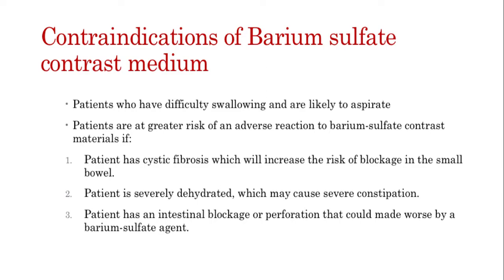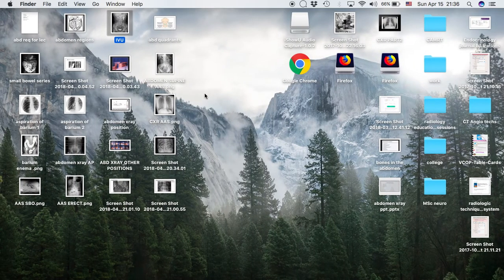So contraindications, this is a very important slide because barium sulfate introduction to the body can have extremely harmful and lethal effects. So patients who have difficulty swallowing and are likely to aspirate. I'm going to show you an image right now. Where is it? Let's see, right here.